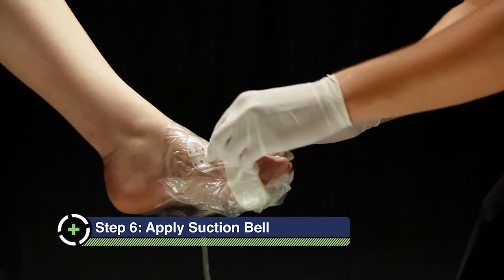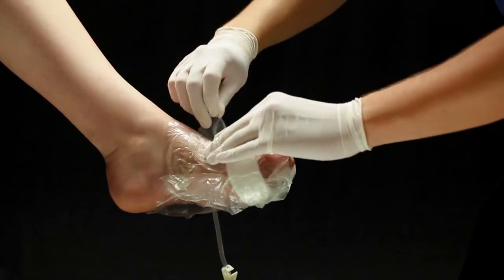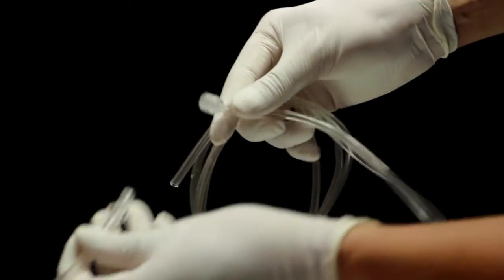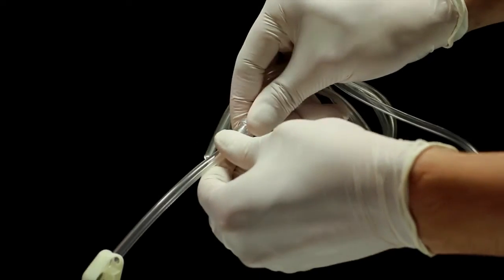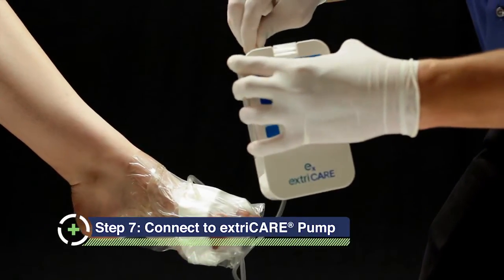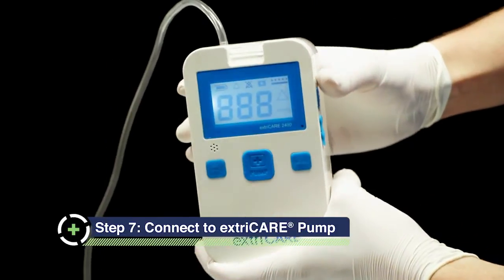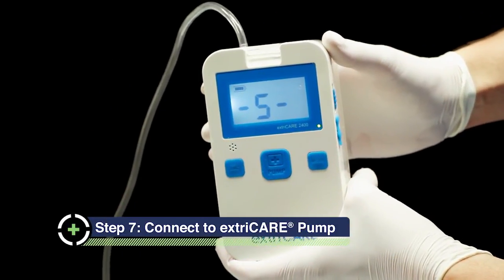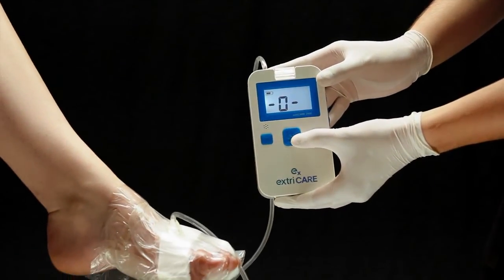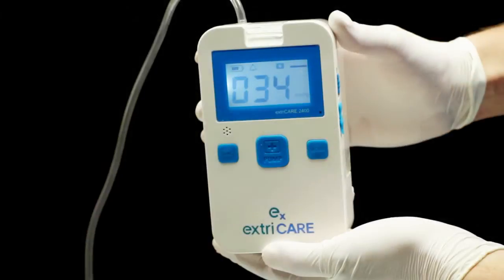Remove the top portion of the backing layer from the suction bell skirt. Attach the connector tubing to the suction bell. Connect the tubing to the extriCARE NPWT pump. Note that it is recommended that the excess drape should be positioned toward the top of the foot and the dressing should be secured with a cover wrap and foot protection. Weight bearing is discouraged. Set the extriCARE NPWT pump to the desired setting and begin treatment.